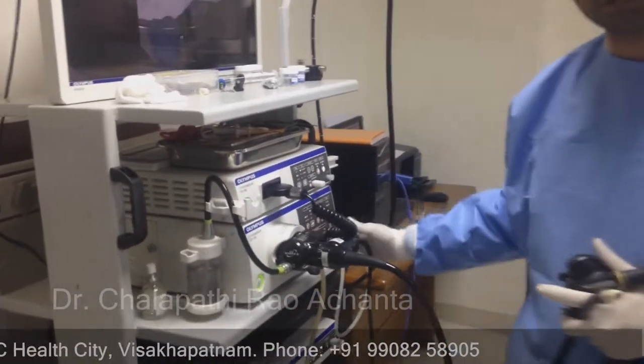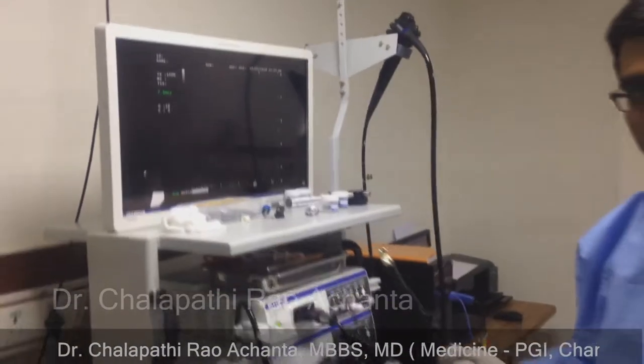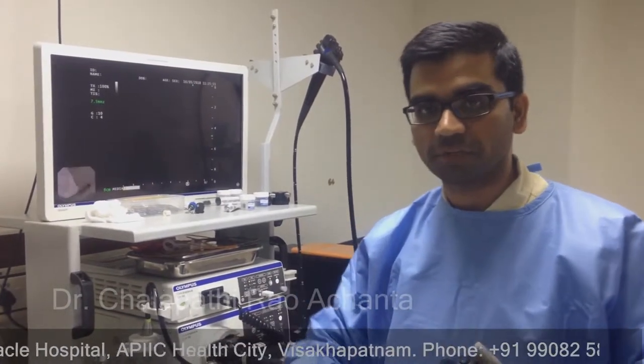This is our Pinnacle Hospital. Endoscopic ultrasound is changed by switch technology — this is an endoscopic image and ultrasound image. We have to sync for better diagnosis and treatment for the patient.